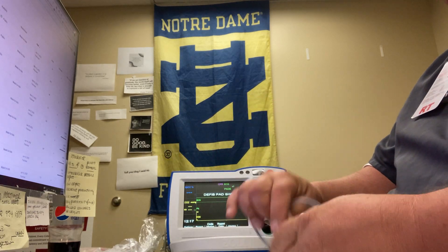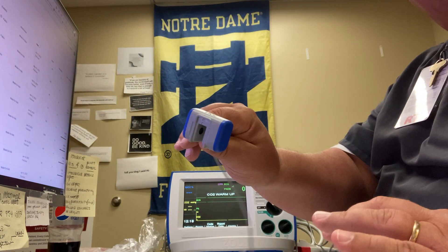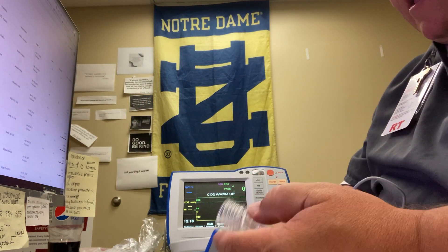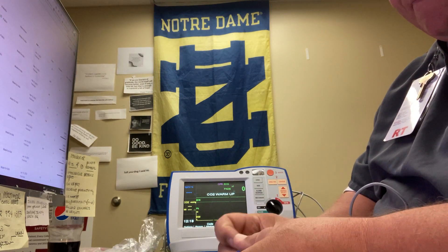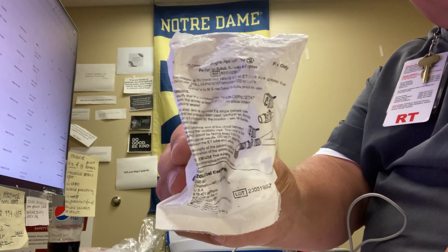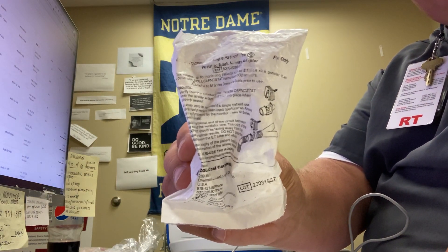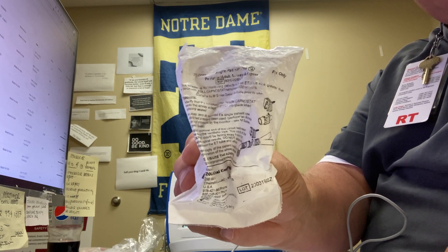The cable is about a four and a half to five foot long cable, and the adapter goes in like so. Adapters come in a package that looks like this. These are in your intubation boxes, and also our code one and code two folks will carry these.